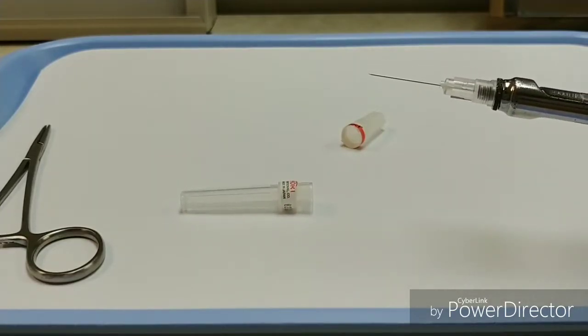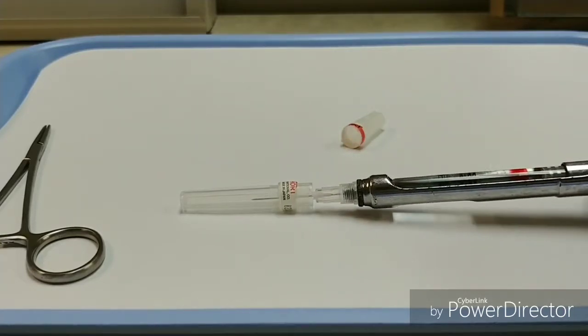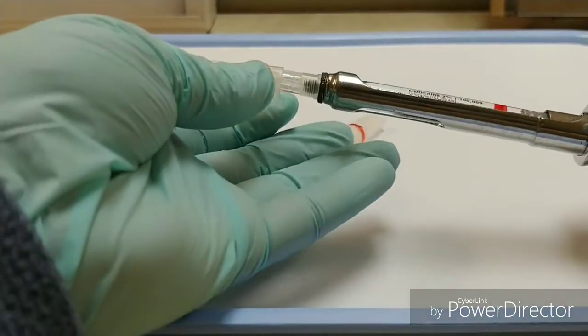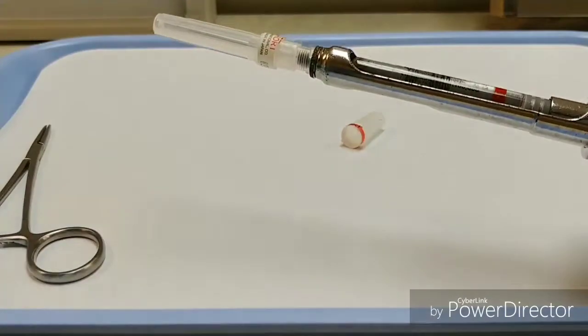Then to recap it safely using the one-handed scoop method, you can use the needle to scoop inside of that cap and pick it up, and then grab the cap near the hub and click it back into place.